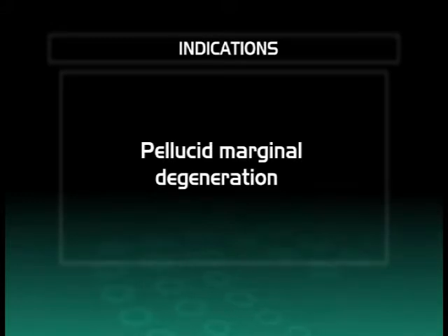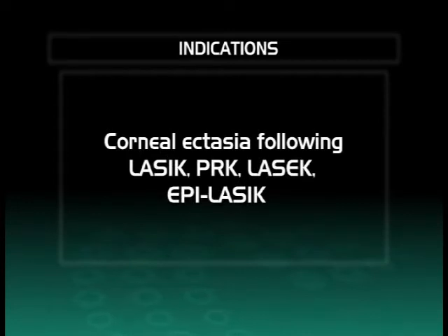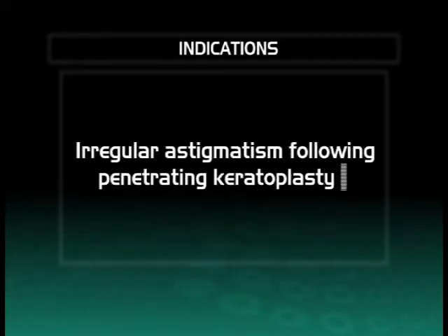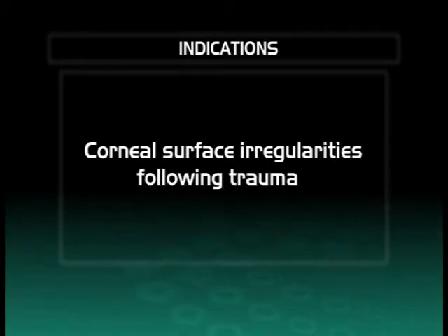Patients with pellucid marginal degeneration. Patients with corneal ectasia following LASIK, PRK, or epi-LASIK surgery. Patients with unstable corneas and irregular astigmatism following radial keratotomy. Patients with previous penetrating keratoplasty and high irregular astigmatism. Patients with corneal surface irregularities after trauma.